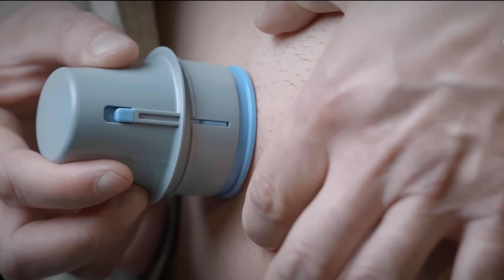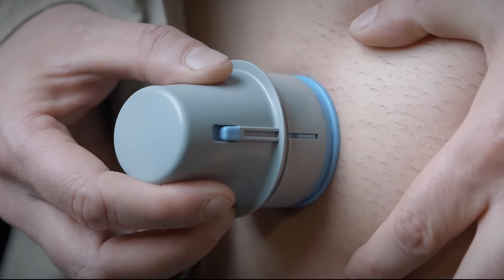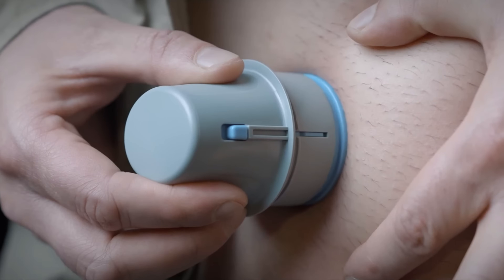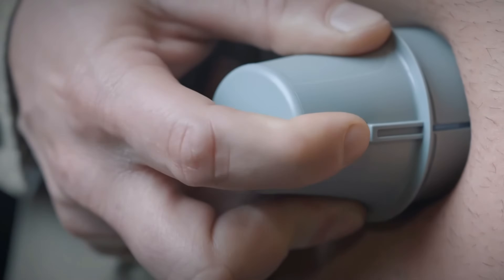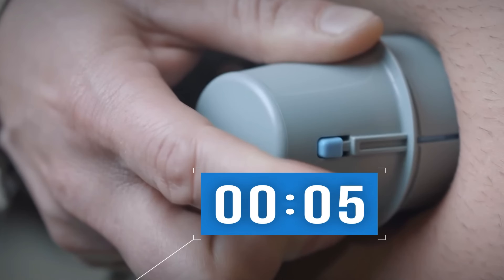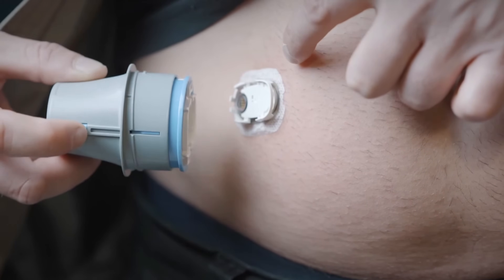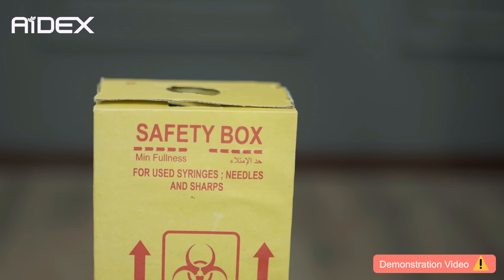Position the applicator horizontally. Gently stretch the skin and press the applicator towards the body until the blue button moves upward. This action occurs only when we push the applicator toward our body. Press the blue button — you will hear the sound of the sensor being released. Wait for about 10 seconds until the sensor is firmly attached to the skin. Carefully remove the applicator. Secure the sensor by pressing on the adhesive on both sides. Dispose of the applicator following medical safety guidelines.